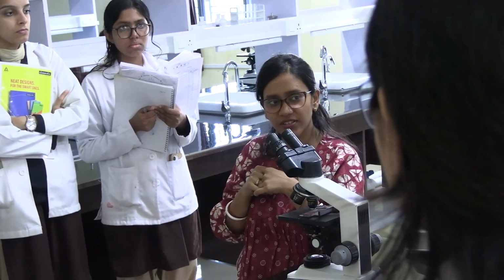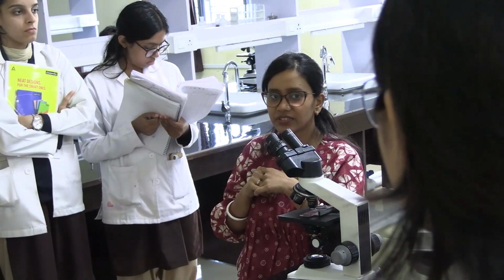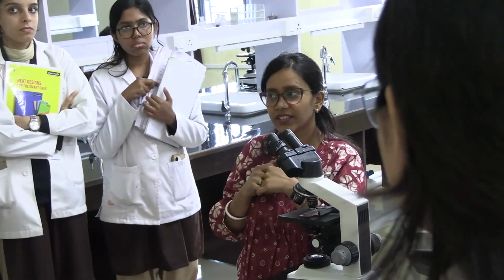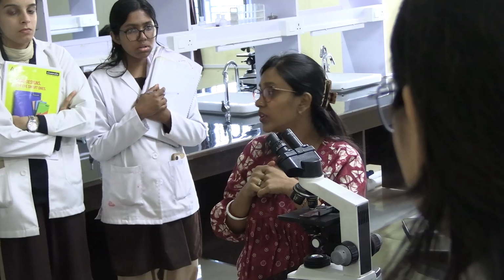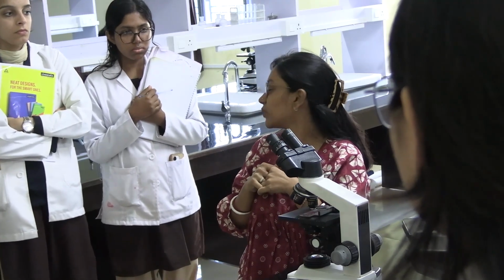What happens to the nucleus? What happens to the chromatin? How does it appear? Euchromatin. Say words only which you are sure about. What will happen? How will it look? Yes? Hyperchromasia, which means it will appear more blue.